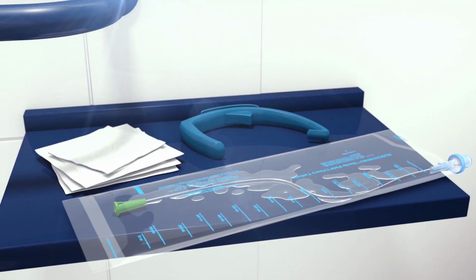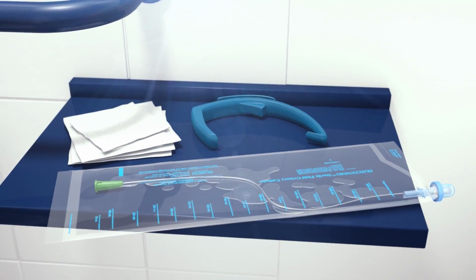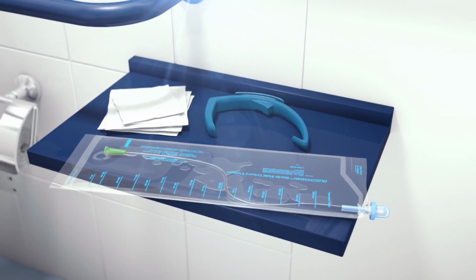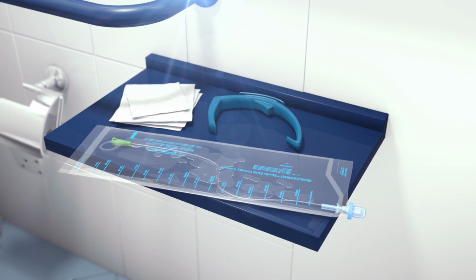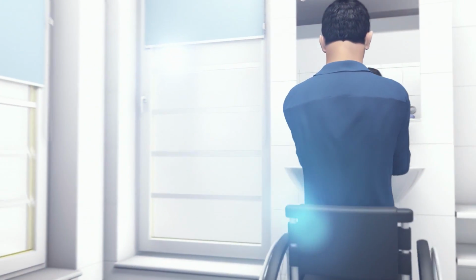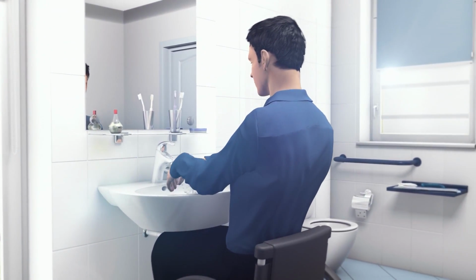For catheterization, you will need a MMG closed system, antiseptic for cleansing the urethra opening or meatus, and if needed, the freehand catheter device from Teleflex. After gathering all the supplies needed, wash your hands thoroughly before performing your catheterization. Having clean hands is one of the best ways to help reduce the risk of infection.